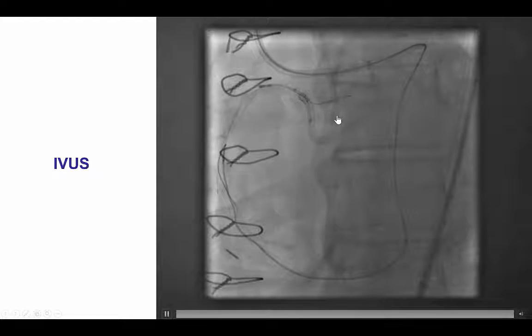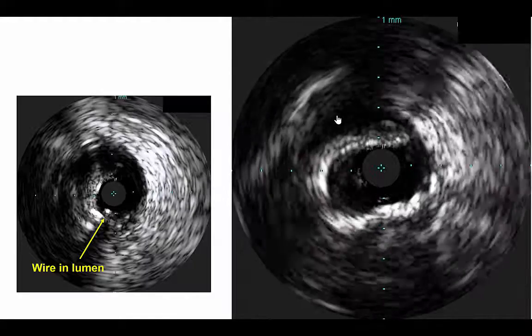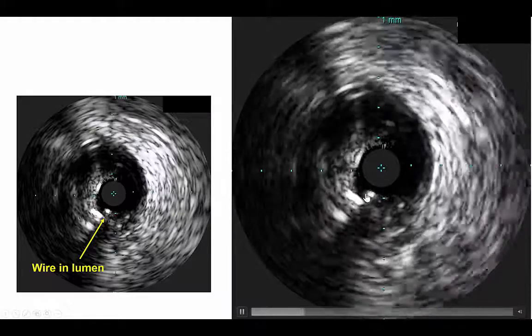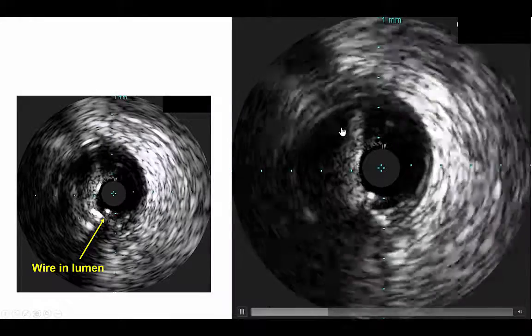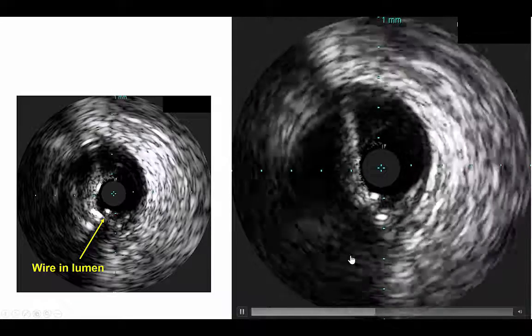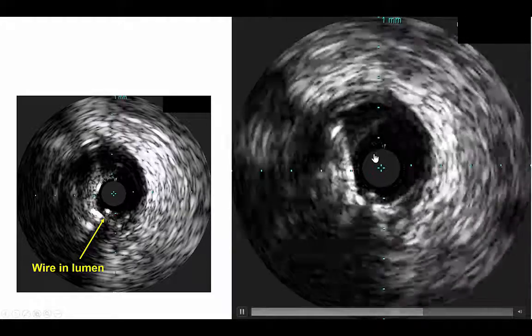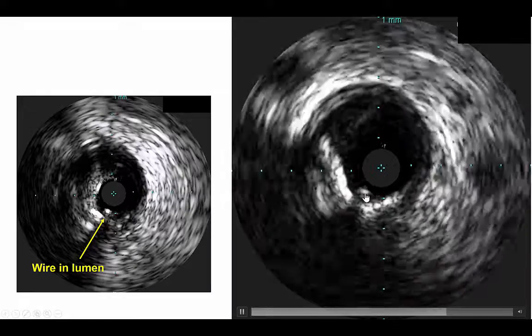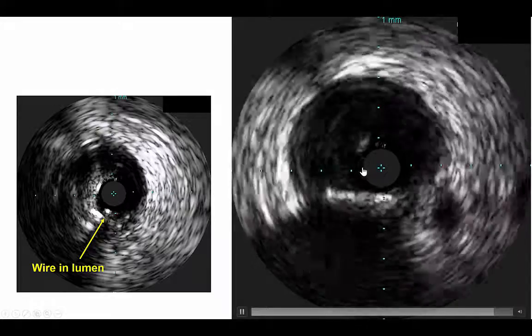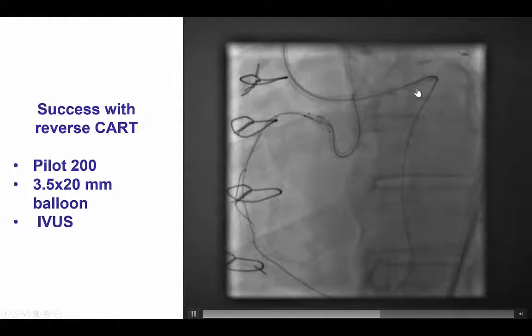However, we were not sure whether the retrograde wire was into the aorta or in the wall of the aorta. We therefore performed intravascular ultrasound, which demonstrated that the retrograde wire was indeed in the proximal true lumen. We know this is the retrograde wire because of the shadow of the ultrasound beam behind the wire, and this wire is in the proximal true lumen, all the way up into the proximal RCA, and then exits into the aorta.